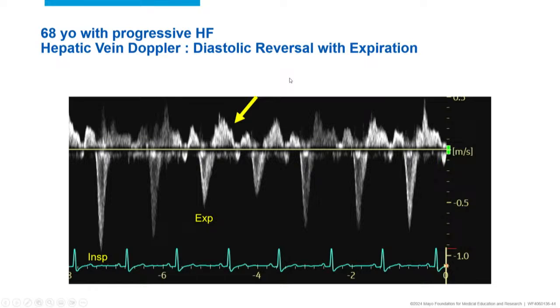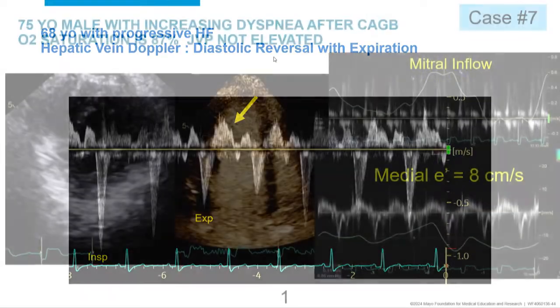That's how we use hemodynamics plus the Doppler echocardiogram. So it's not really unusual for us. We get a call even from the cath lab saying, "What do you think on the echocardiogram?" Right? So it's not always one is straight and the other is not. We really have to work together to come up with the correct diagnosis for the patients, because this is something that we can cure with a pericardiectomy, compared to myocardial disease.